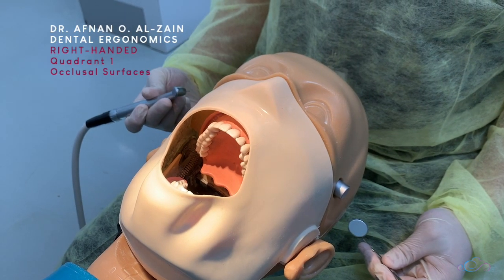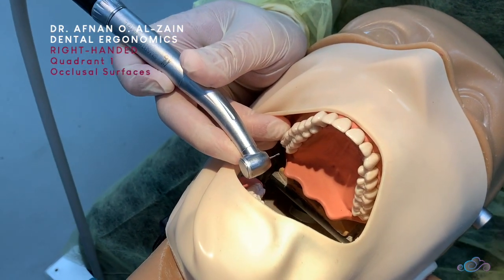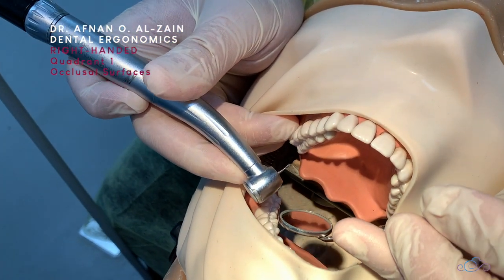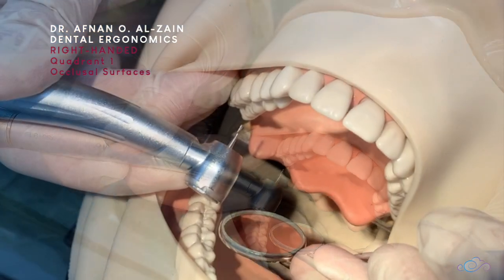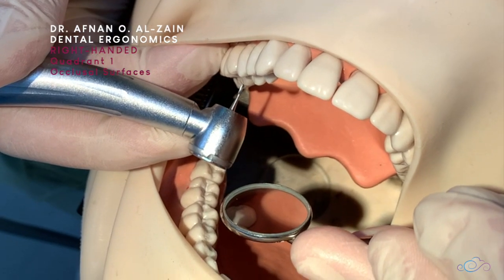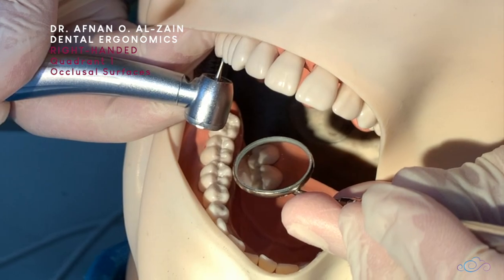When working on the palatal surfaces of quadrant one, you're going to sit behind the patient, retract the cheek, and place proper finger support. Then place the mirror at an angle where you're going to look indirectly through it. Make sure the burr is perpendicular to the surface and that you can see clearly from the mirror.